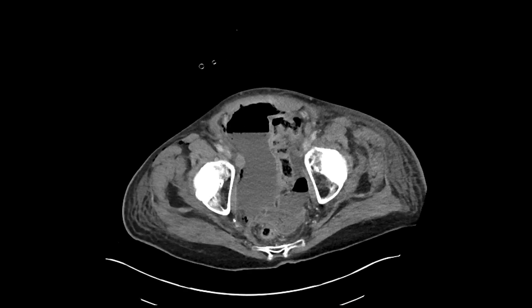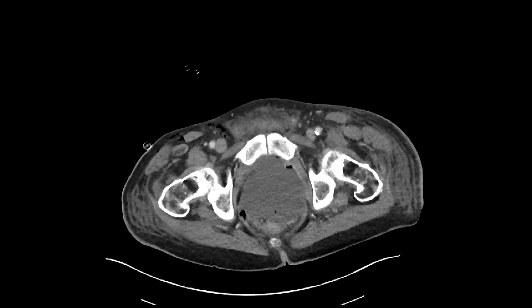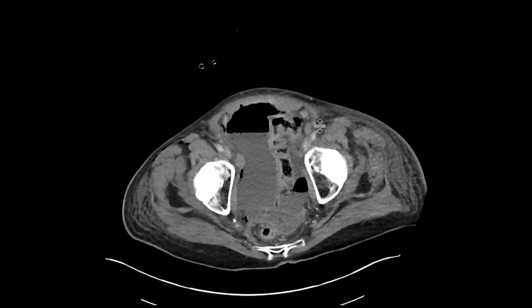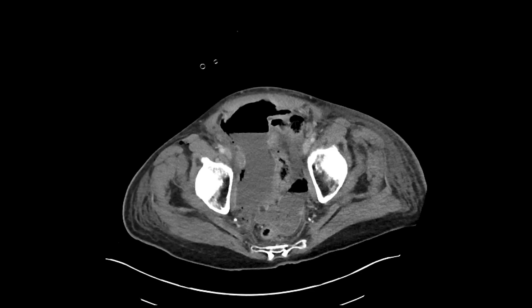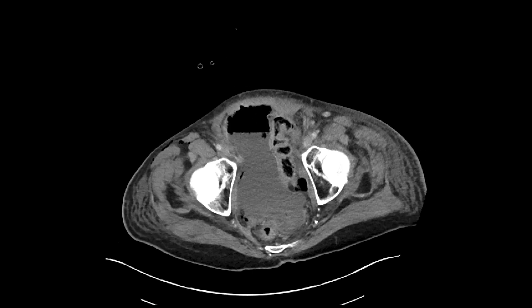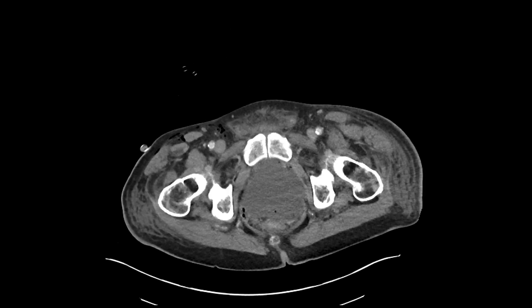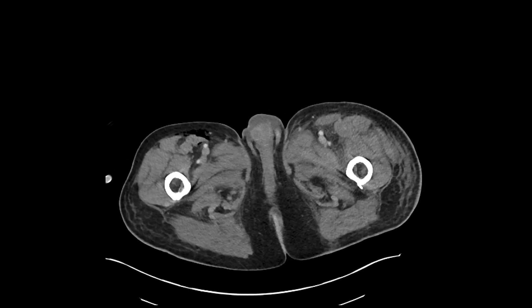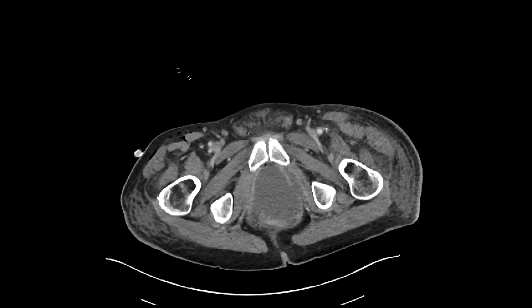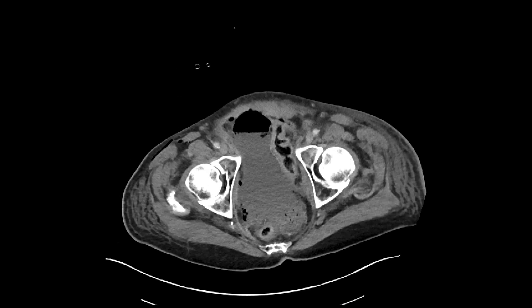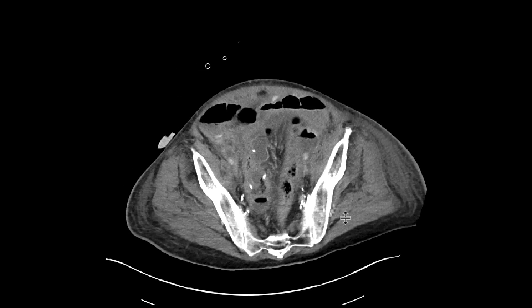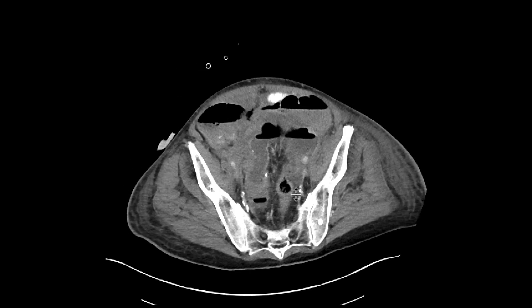As we go down to the pelvis, we can see that there are large pelvic collections. They contain foci of gas, and these are compatible with abscesses. So why does this patient have all these abscesses? Well, we can start to follow the sigmoid colon a little bit to try to figure this out.